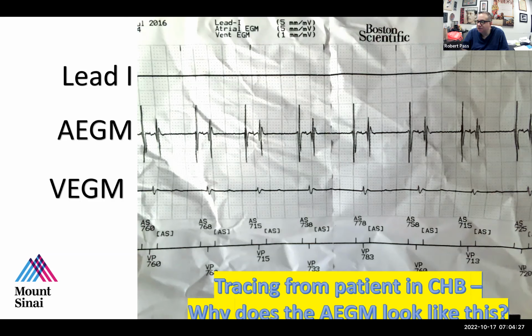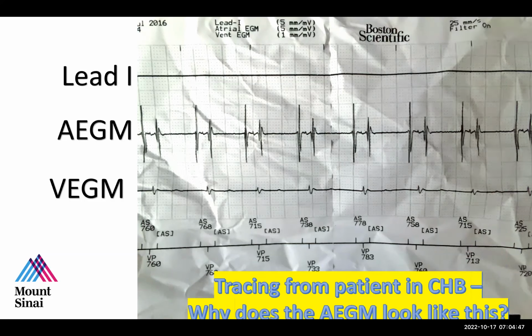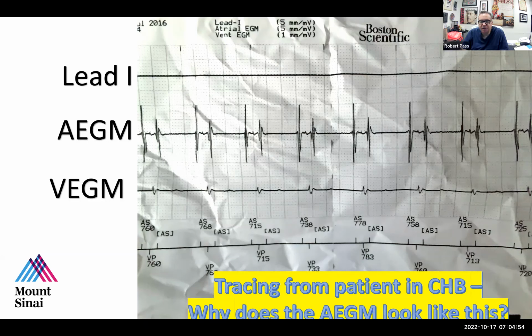Maya, any thoughts on the location in the atrium where we would put the lead, which is the standard, at least the first best choice usually? So I'm not entirely sure, but we said high right atrium, is it near the SVC RA junction? It is, but I'll just answer the question. It's the right atrial appendage. That's usually the most common location that we shoot for, the RA appendage. The reason we do that is we think it's a more stable location for the lead. And as you know, that is kind of high in the right atrium.